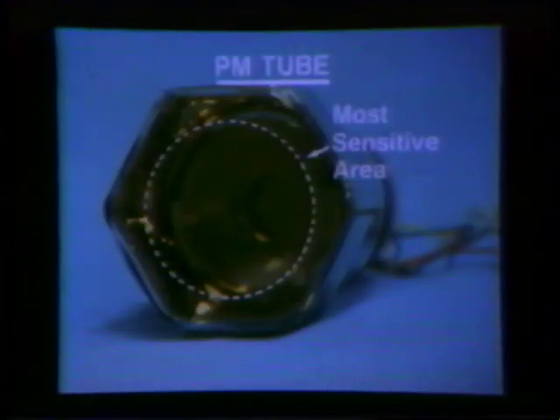To create an image, we must first correct the electronic signals for distortions which are inherent in any gamma camera detector. To understand how correction takes place, let's start with the X and Y positional signals. As we've just learned, by analyzing all the signals from all the tubes, the resistor summing matrix can calculate where in the crystal the photon interacted.